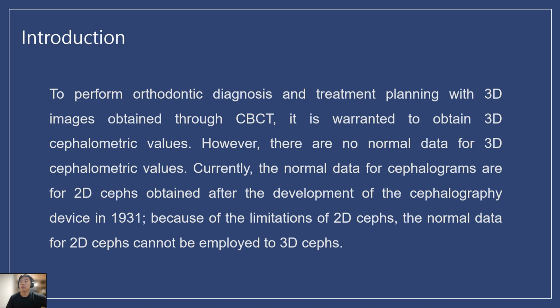To perform orthodontic diagnosis and treatment planning with 3D images obtained through CBCT, it is warranted to obtain 3D cephalometric values. However, there are no normal data for 3D cephalometric values. Currently, the normal data for cephalograms are for 2D images obtained after the development of the cephalography device in 1931.